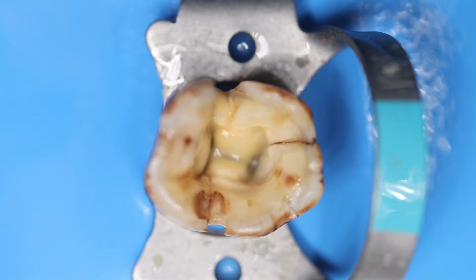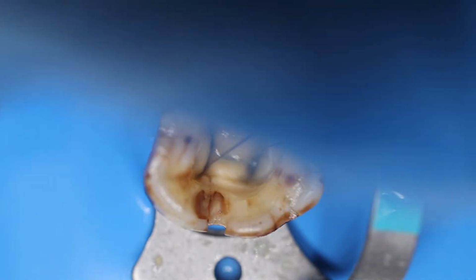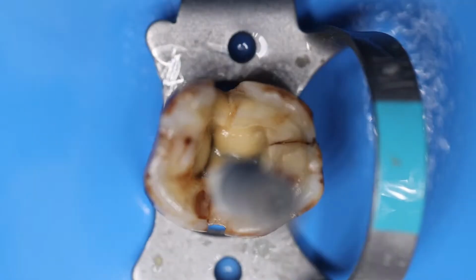Now when you are done with the distal, you can move into the mesial orifices. This is the mesiobuccal. You can just leave the file and it is engaged at an angulation in the mesiobuccal. We have not taken the working length, we are just going for the initial negotiation. Okay, as far as the file can go freely into the canal.